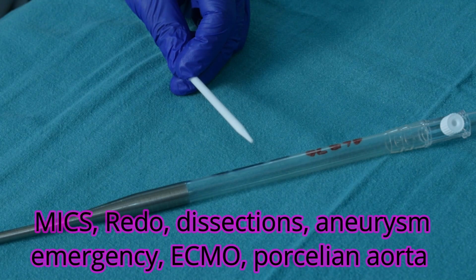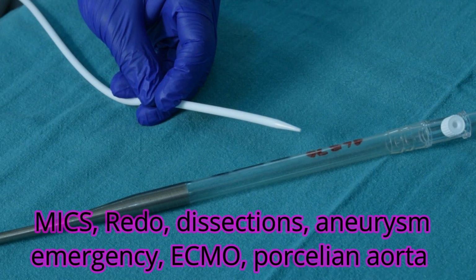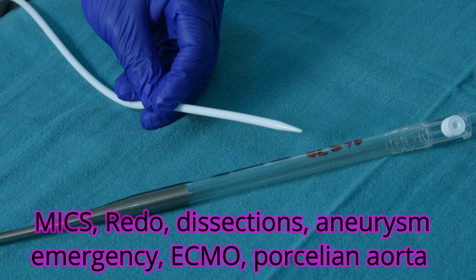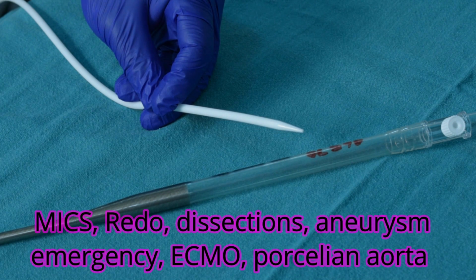Mind you, a preoperative CT aortogram of the ascending aorta, arch, thoracic aorta, descending aorta would be an absolute must just to make sure that there are no gross atheromatous changes in the abdominal aorta. More atheromatous changes, more risk of stroke or shower going to the brain because of the retrograde or antiphysiologic flow from the femoral artery.